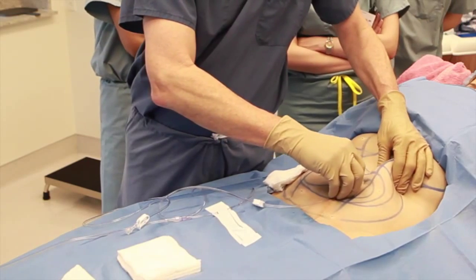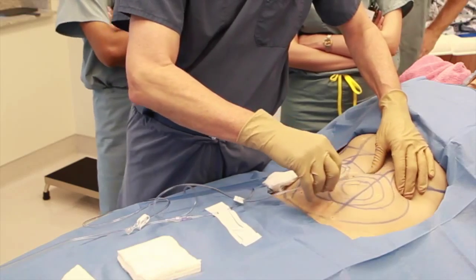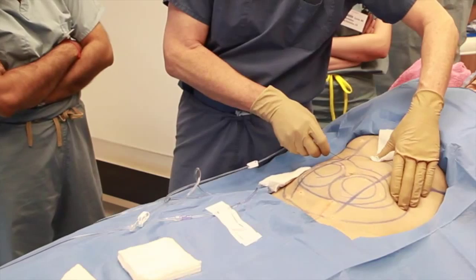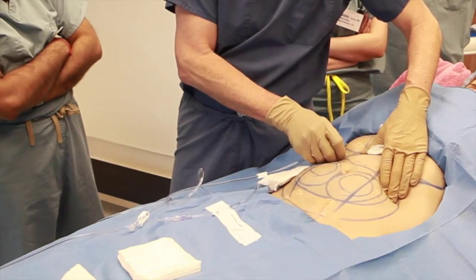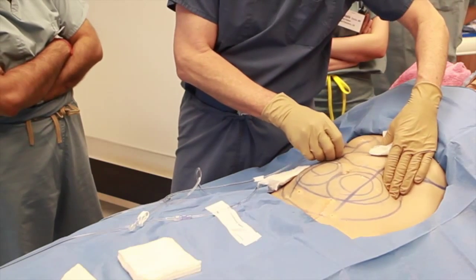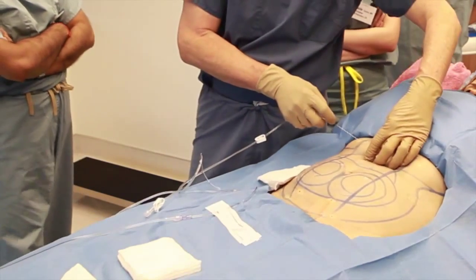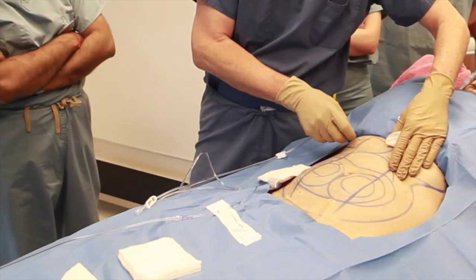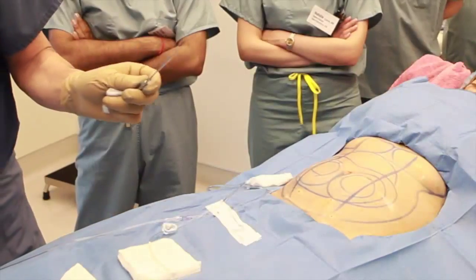Here we're using a 20-gauge spinal needle to infiltrate a relatively small amount of tumescent local anesthesia — tumescent lidocaine anesthesia. The small volume is intended to infiltrate just enough to allow subsequent passage of a larger blunt-tipped Monty cannula, which will do most of the infiltration. We'll infiltrate in different directions, and then later when the Monty cannulas are inserted, we will follow the same path.